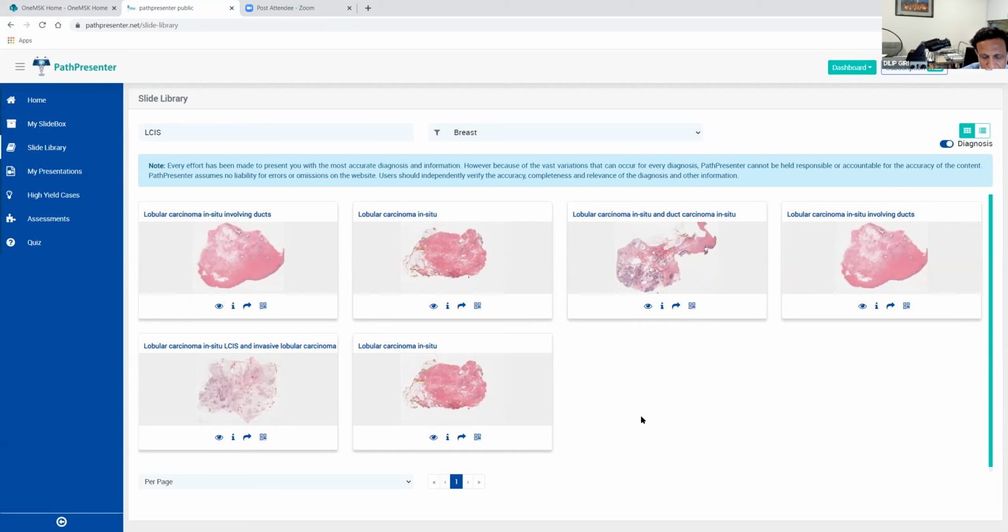The cells themselves are screaming out that I am malignant, so obviously they are going to behave in a malignant fashion. But there is no definitive, conclusive data for the big committees to come out with recommendations on what to do with this, whether to radiate and so on.